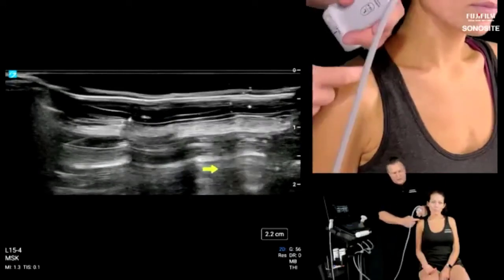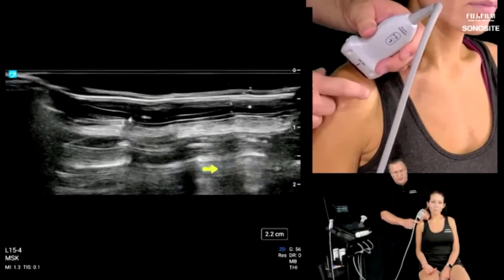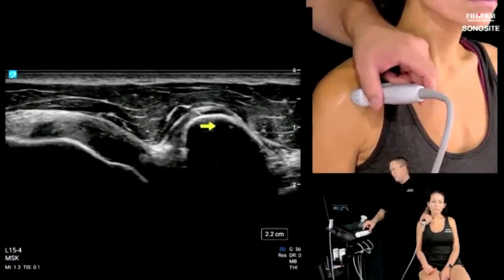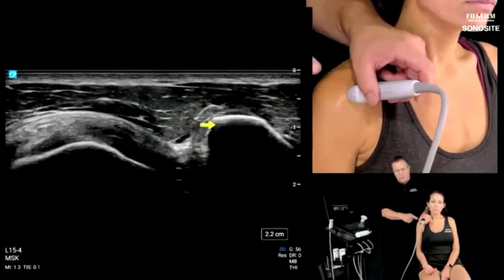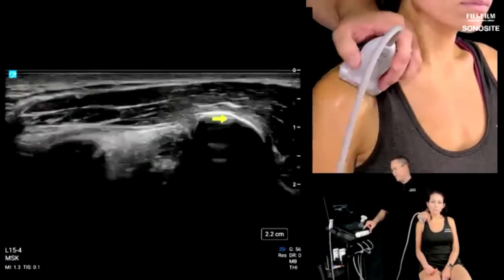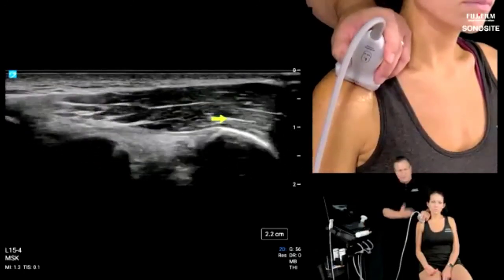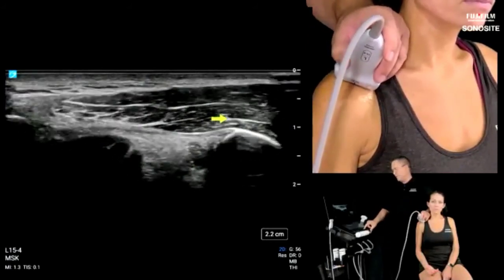So we've got the left side of the screen towards the acromion, and the right side of the screen towards the coracoid. Let's find the coracoid first on the right side of the screen. Then I'm going to swing my thumb side of the probe north, keeping the left side of the screen pivoting on the coracoid, but bridging that gap to the acromion. Mainly, I'm angling almost 12 o'clock back into the shoulder, and we want to see this ligament here.